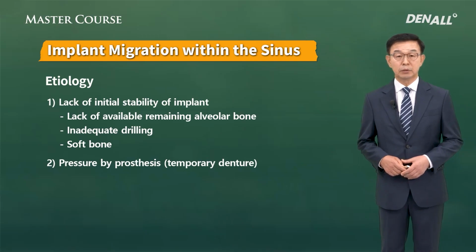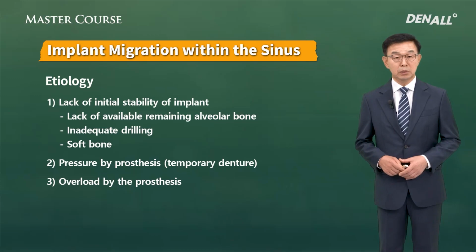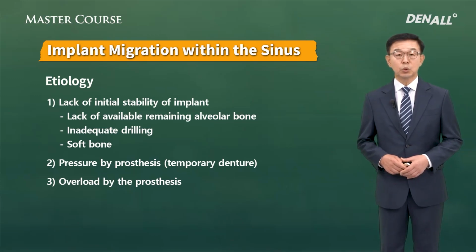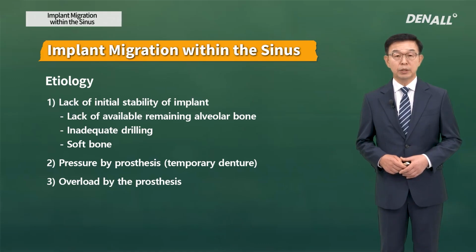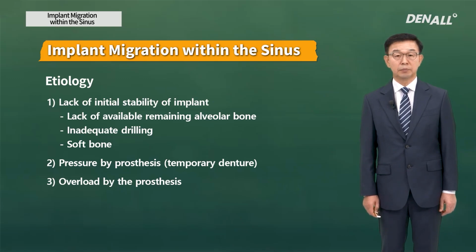Another cause would be the masticatory force applied to the temporary prosthesis during the observation phase. The final instance is quite rare. However, after the final prosthesis is delivered and occlusion is formed, the implant can migrate into the sinus. It's quite rare, but it has been observed.